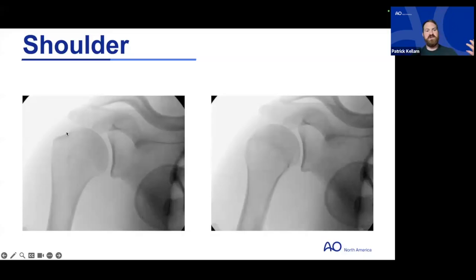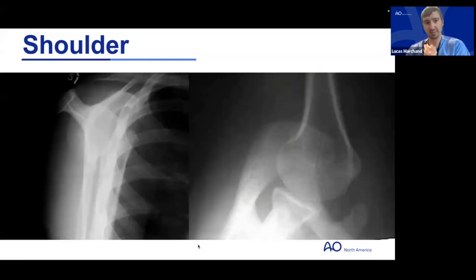Sometimes it can be confusing because the joint has so much range of motion and degrees of freedom in what the actual proximal humerus AP is. You should be able to see a clear differentiation of the articular surface and the greater tuberosity. So the image on the left I would consider to be a perfect AP of the humerus, while it's a Grashey view of the shoulder. Awesome. That's a great description, and very educational to see these contrasting images side by side.